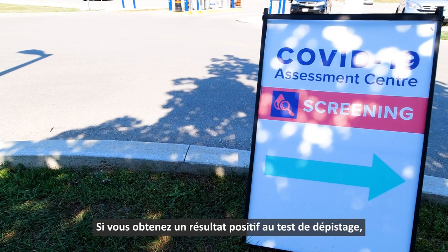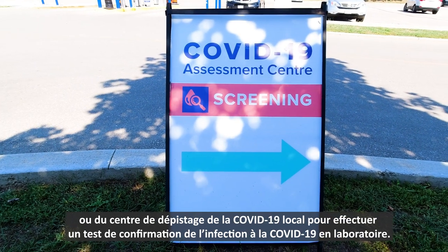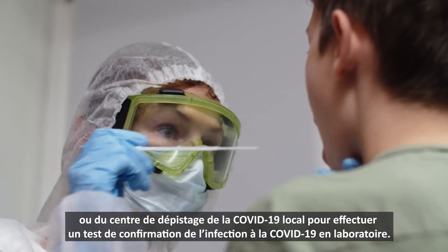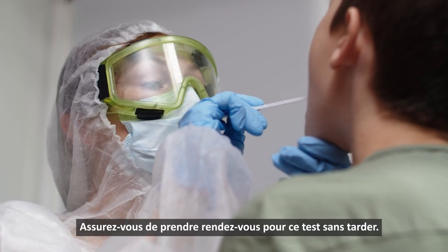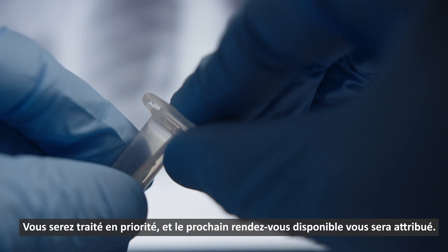If your test shows a positive result, you will need to make arrangements with your local public health unit or COVID testing clinic to get a lab-based confirmation COVID test. Make sure to arrange for the second test right away. You will be prioritized for the next available appointment.